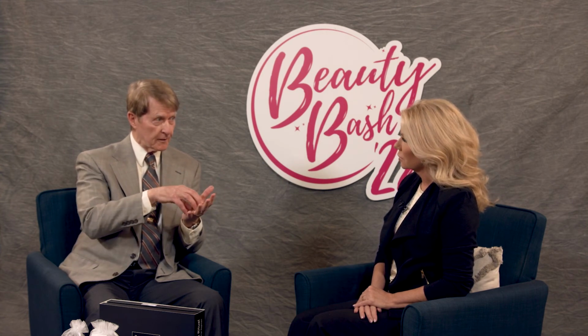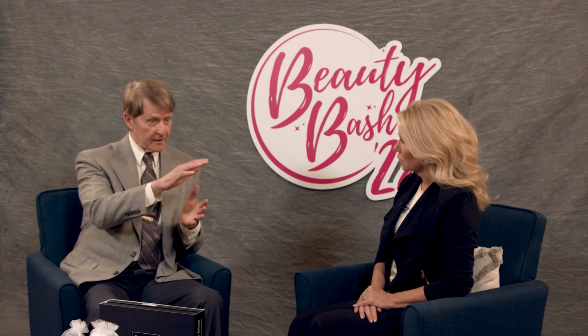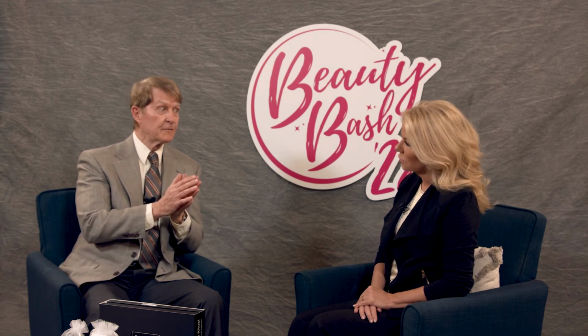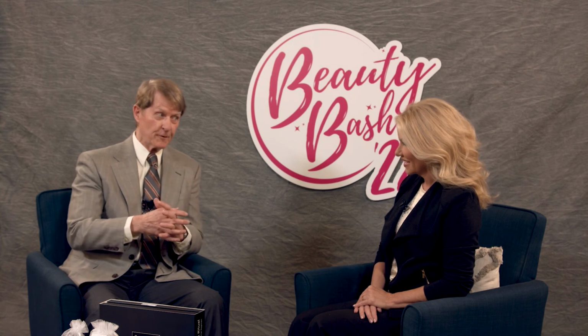What was the downtime? Well, there is a bit of downtime with this. You need to be motivated for this kind of treatment. It's a hot beam, so there's going to be some heat applied to the skin. And we're making microscopic little holes in the skin that can be controlled in depth or can be controlled in density. So, for example, if I shone the laser on your skin with, say, a 10% coverage, you might not even feel that. But if I did a 50% coverage, you would definitely feel it. And you would probably ooze and be red for several days.